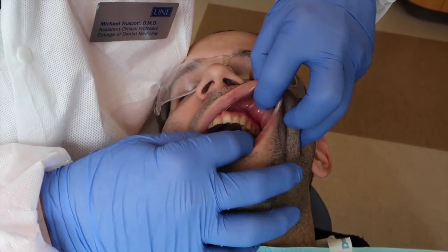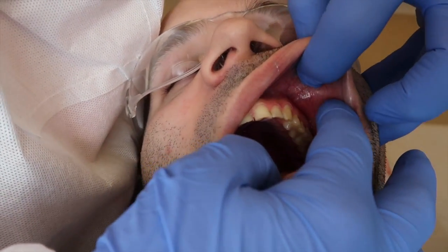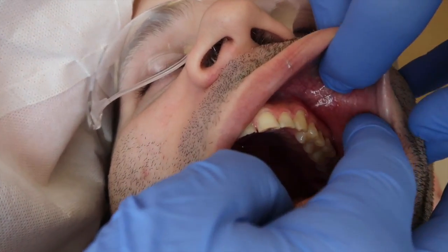You can see this puckered, shiny tissue — the area where the topical has done its magic.